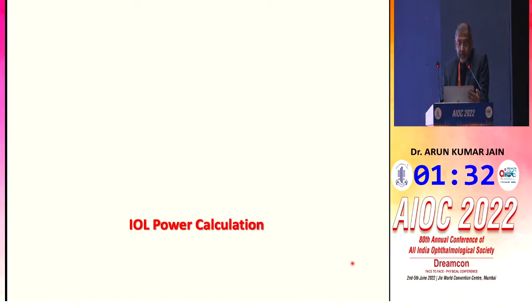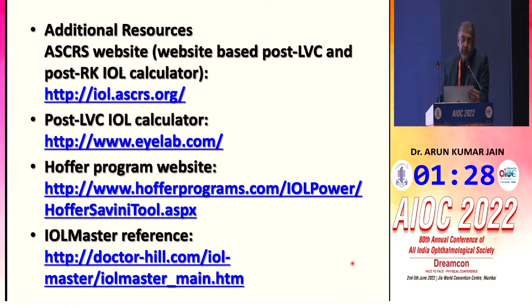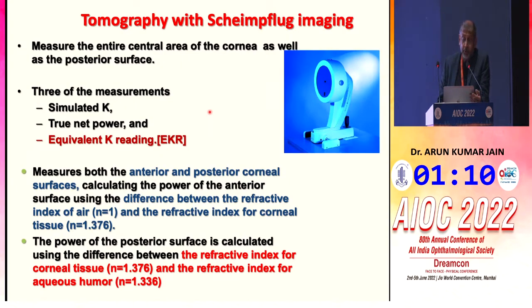Coming to IOL power calculation in post refractive surgery patients, if you don't have a Pentacam, you don't have to worry. You can go online. There are the ASCRS website as well as APACRS, where you can have all these online calculators. But you can also have the tomography.